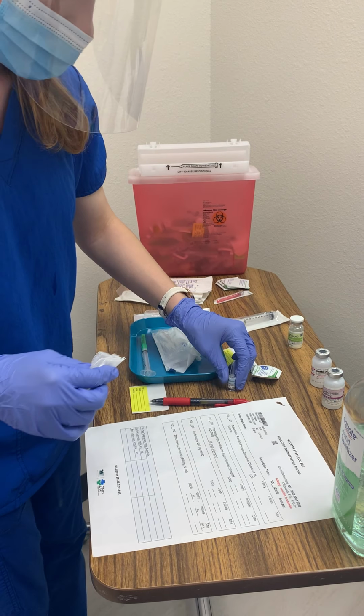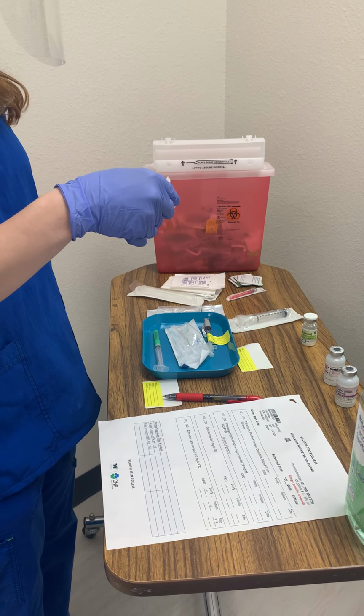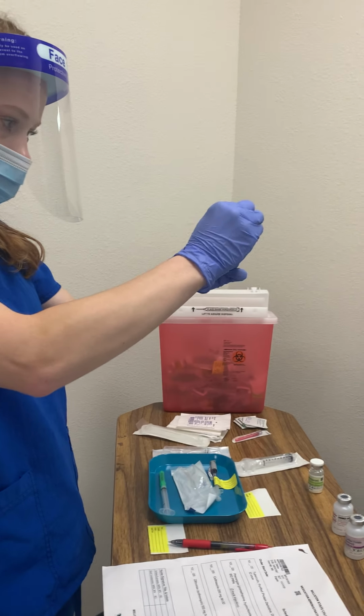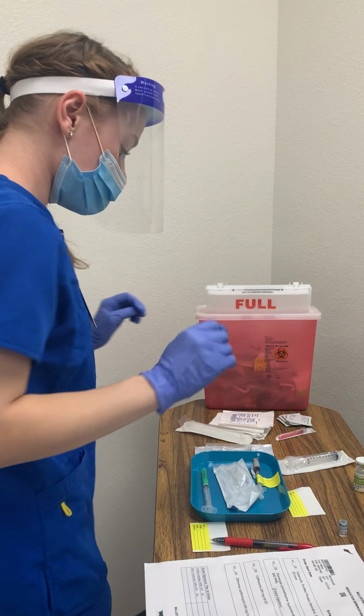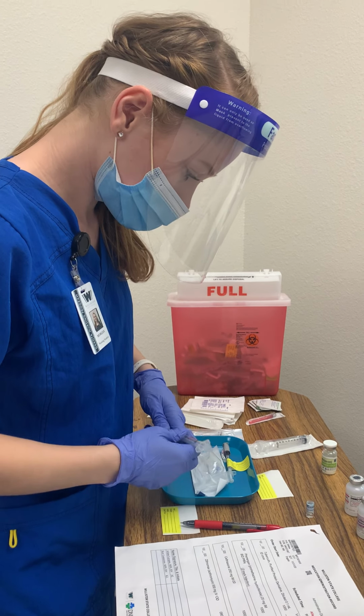So I've let this air dry, throw this away as well. And then I'm gonna break this away from me. So 1, 2, 3, perfect. Put there, and then I'm gonna put this in my sharps container because we don't want glass in the garbage.